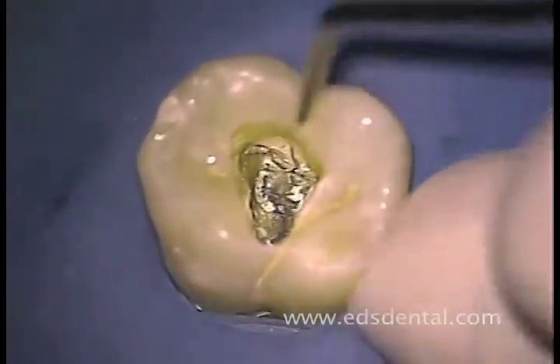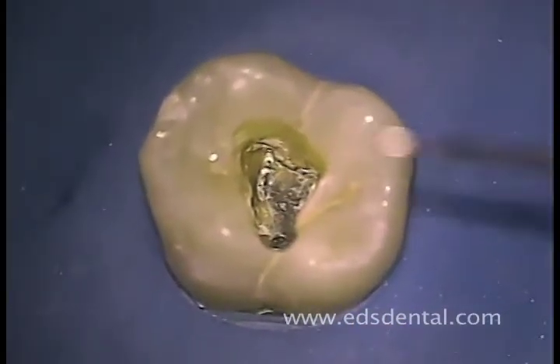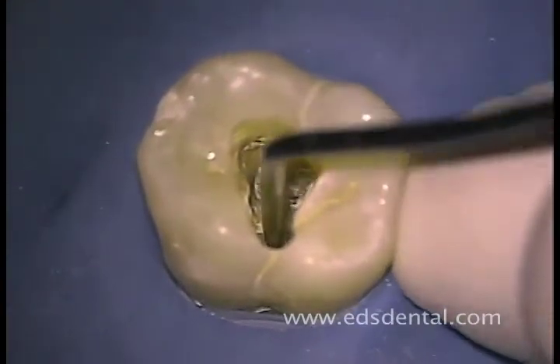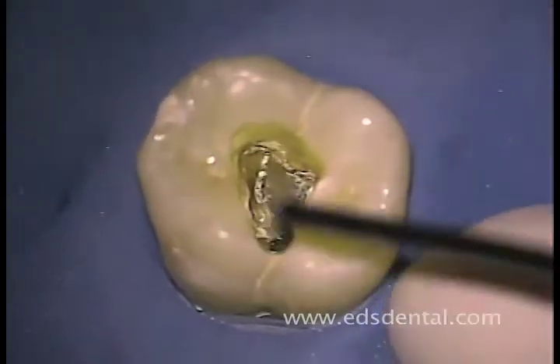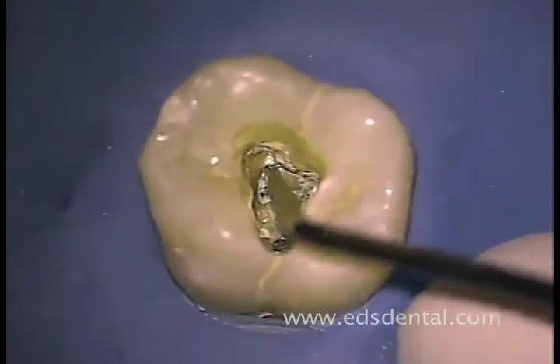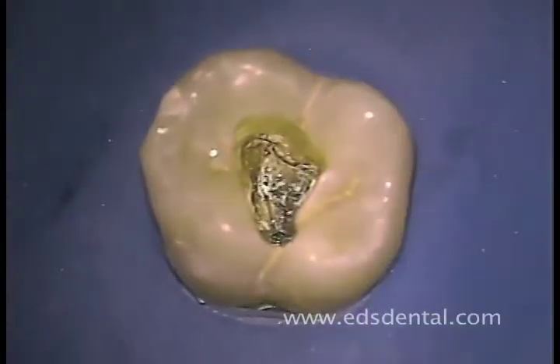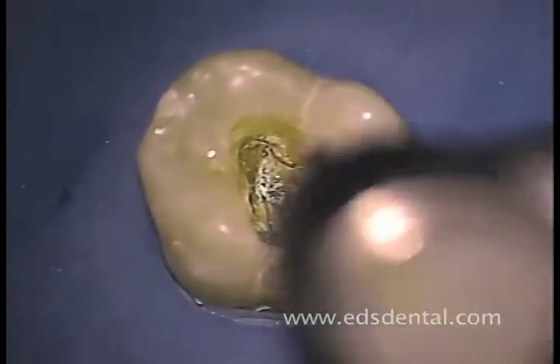Sometimes these pulp stones adhere quite strongly to the floor and have to be drilled away. However, this one detached easily. Further exploration of the pulp floor lets me know exactly where the mesial buccal, distal buccal, and palatal orifices are. To see them more clearly, I extend the access opening a bit with the No. 4 high-speed surgical length round burr and recheck my pathway to each canal orifice with the explorer.